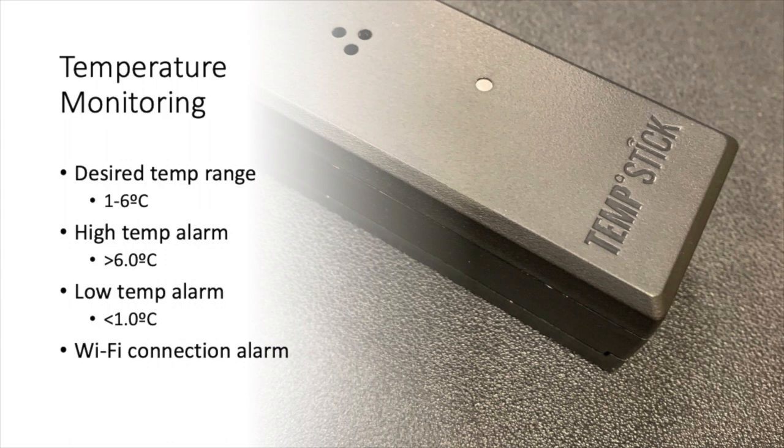It is our regional recommendation that agencies utilizing the TempStick set a high temperature alarm greater than 6 degrees and a low temperature alarm less than 1 degree centigrade. We also recommend a Wi-Fi connection alarm that will alert you should this TempStick drop offline.